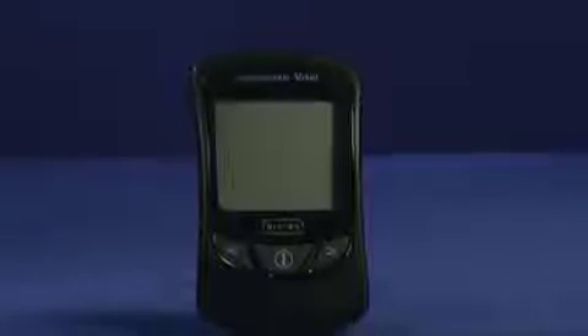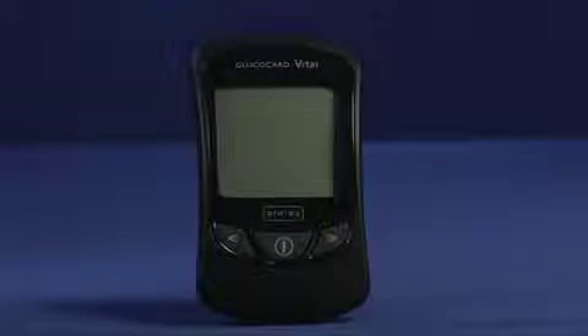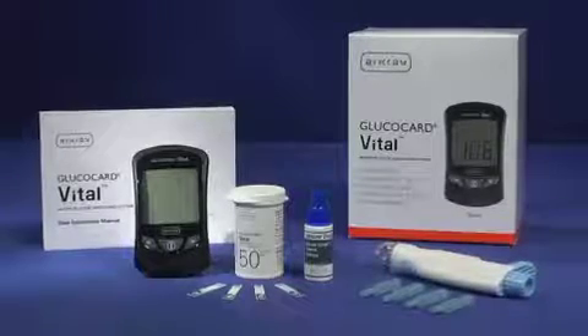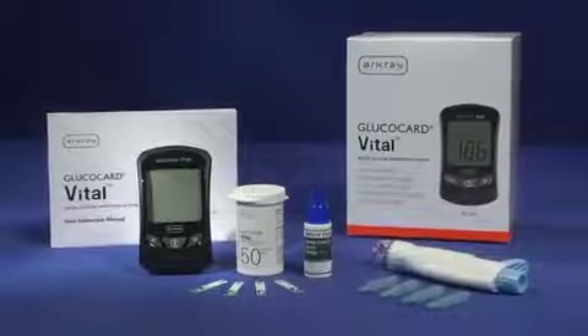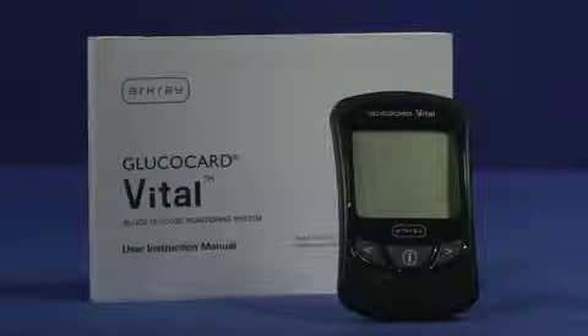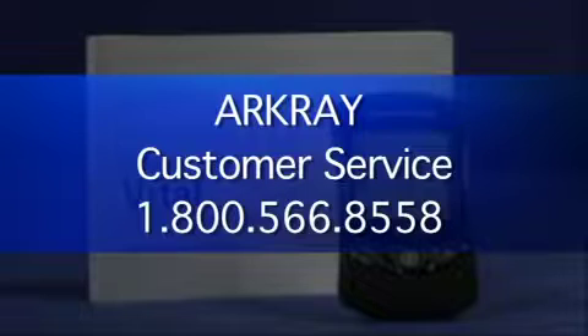The Glucocard Vital Blood Glucose Monitoring System is for self-testing. It provides a fast, easy, and accurate method of determining blood glucose values. This training video will provide basic instructions on how to use the Glucocard Vital Blood Glucose Monitoring System. Please read the Glucocard Vital User Instruction Manual for complete instructions before using this system. For additional assistance, please call ARKRAY Customer Service at 1-800-566-8558.